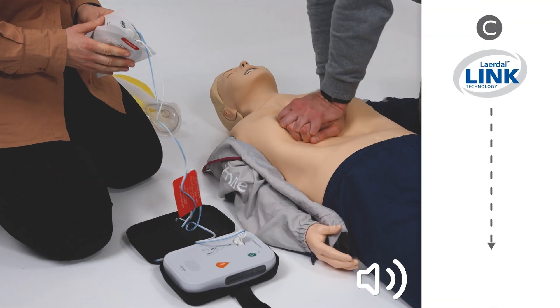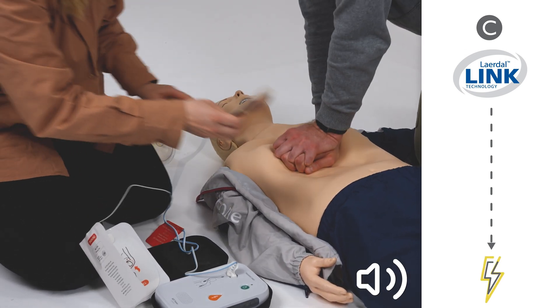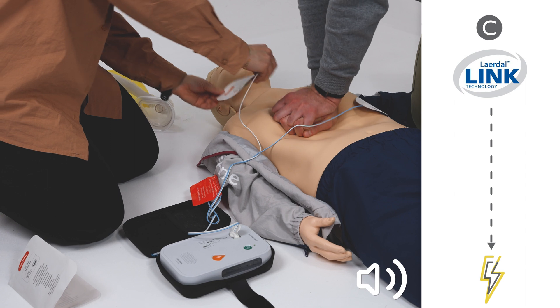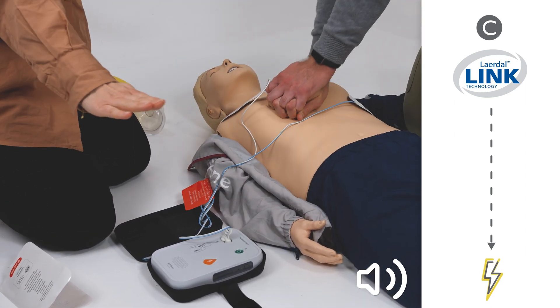Remove clothes from patient's chest. Apply the pads to the patient's bare chest exactly as shown on the pads. Pads must not be touching clothing or each other. Stay clear of the patient. Analyzing heart rhythm.